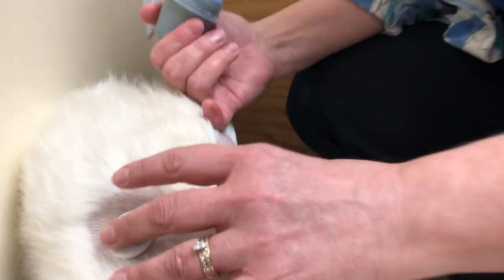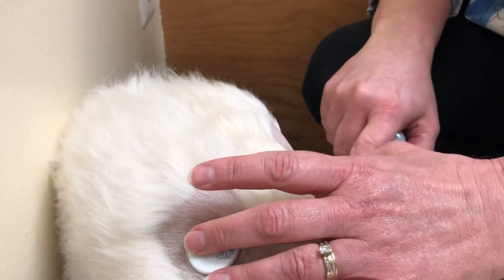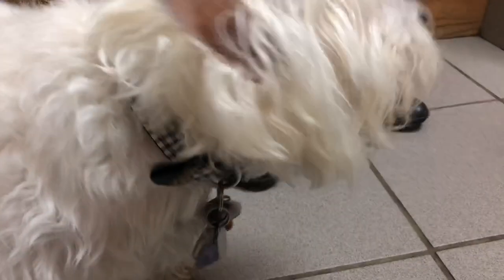That's it. Yay! Good girl! So there's her new one. And then typically we date them, so we know when we put them on, and it just gives us some information. And that's the Freestyle Libre and our wonderful mom, Delilah.